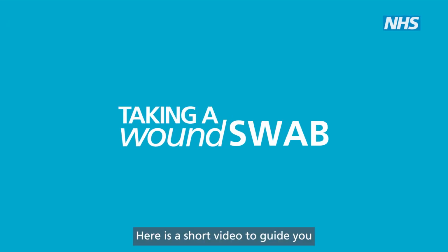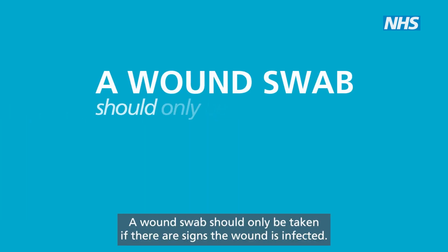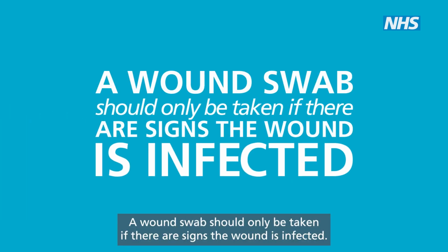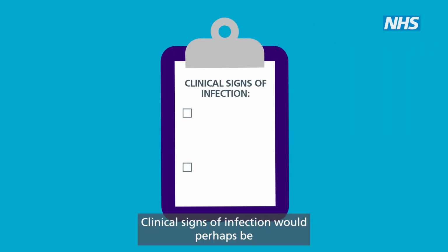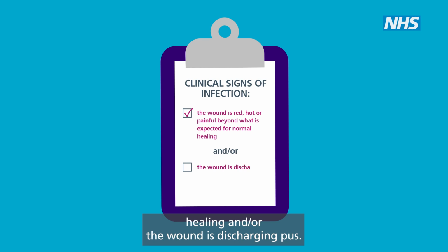Here is a short video to guide you through the correct process for taking a wound swab. A wound swab should only be taken if there are signs the wound is infected. Clinical signs of infection would perhaps be the wound is red, hot, or painful, beyond what is expected for normal healing, and/or the wound is discharging pus. If present, pus is a better specimen than a swab.